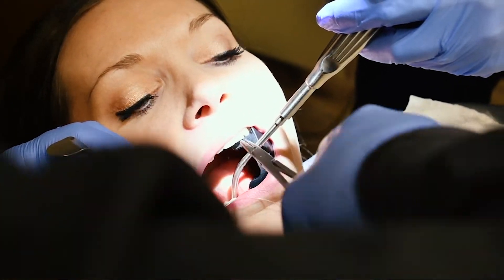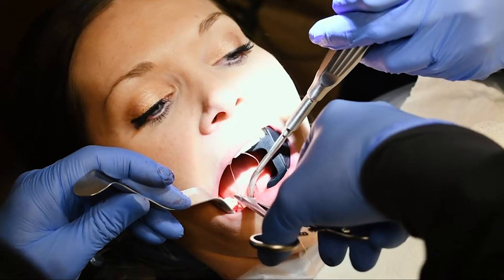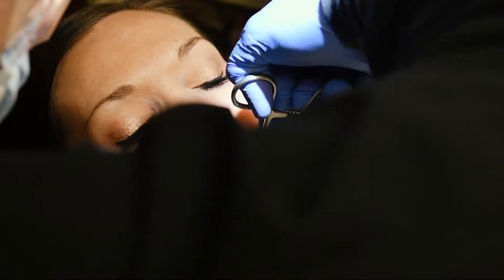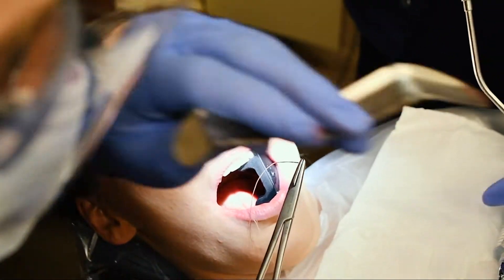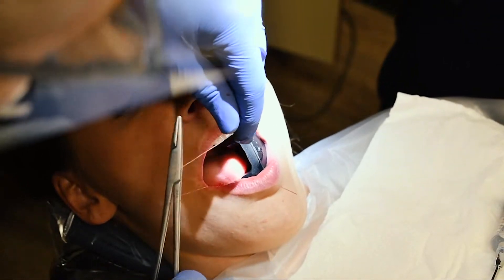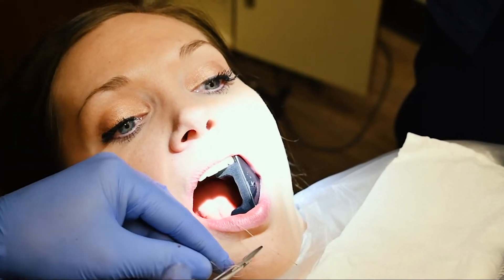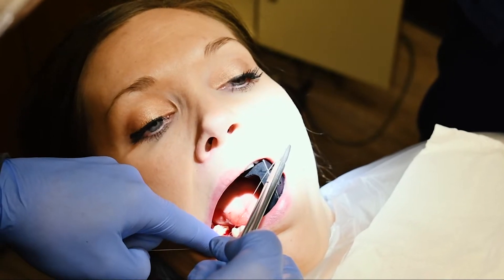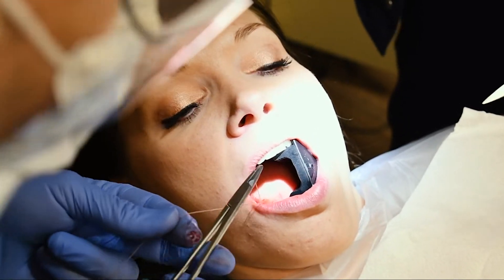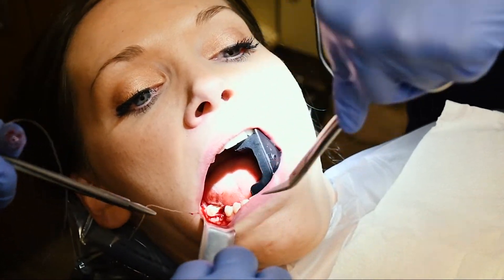These are nice little surgeries. Last stitch. I'll call you later today to check up and see how you're doing. We're going to give you some instructions for afterwards — I'd like five days of antibiotics, and make sure you take some probiotics for your stomach at the same time. We have some at the front desk. I'd like to see you back in a week to make sure you're doing well. Great job.